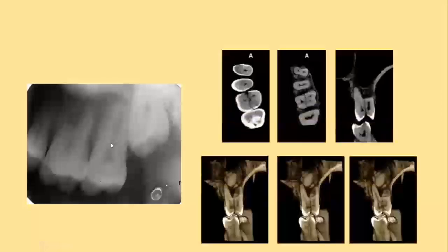I was wondering what had happened, thinking, oh, the apex is cut off, let's repeat. Those thoughts came in. But then we said, okay, let's take a CBCT. On the CBCT, you see these axial images. For now, let's call them axial. We haven't gone there still, but just to let you know, you see that nice fracture line. And here, the coronal going right through the furcation area. You see the 3D reconstruction. And this was literally a vertical fracture involving the furcation area.